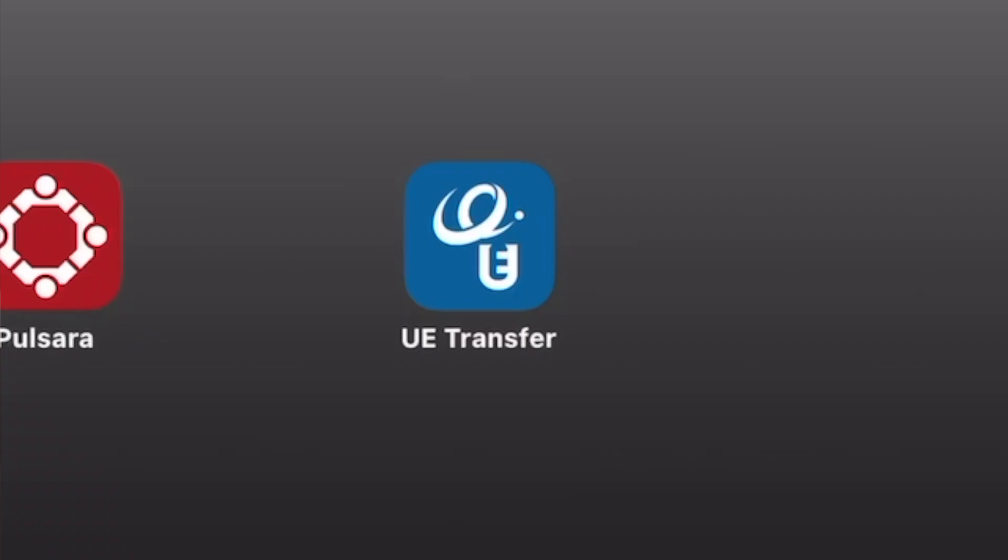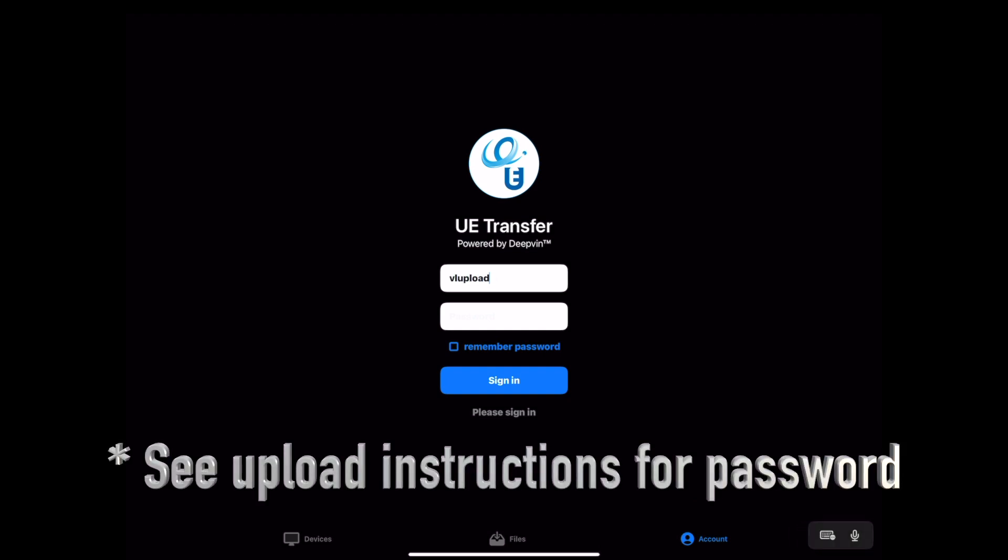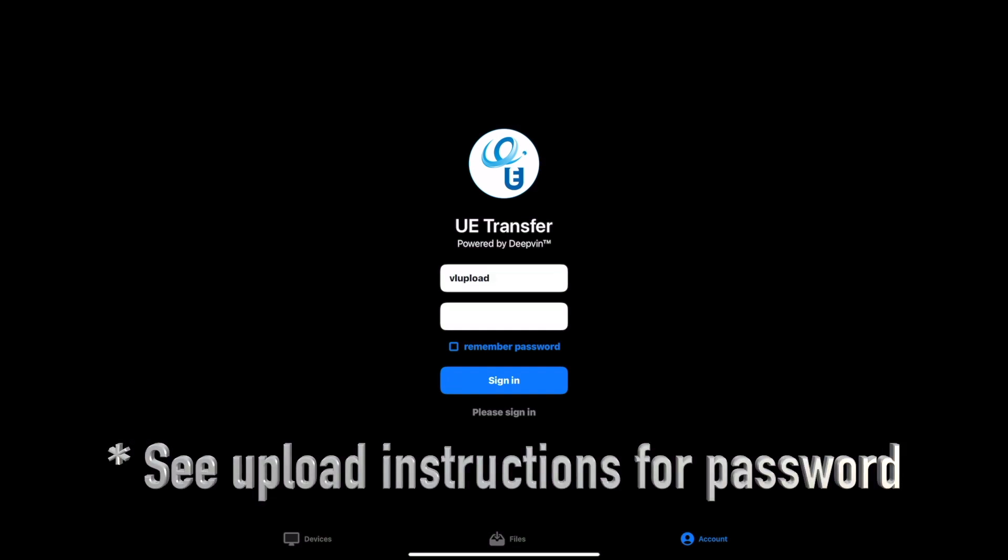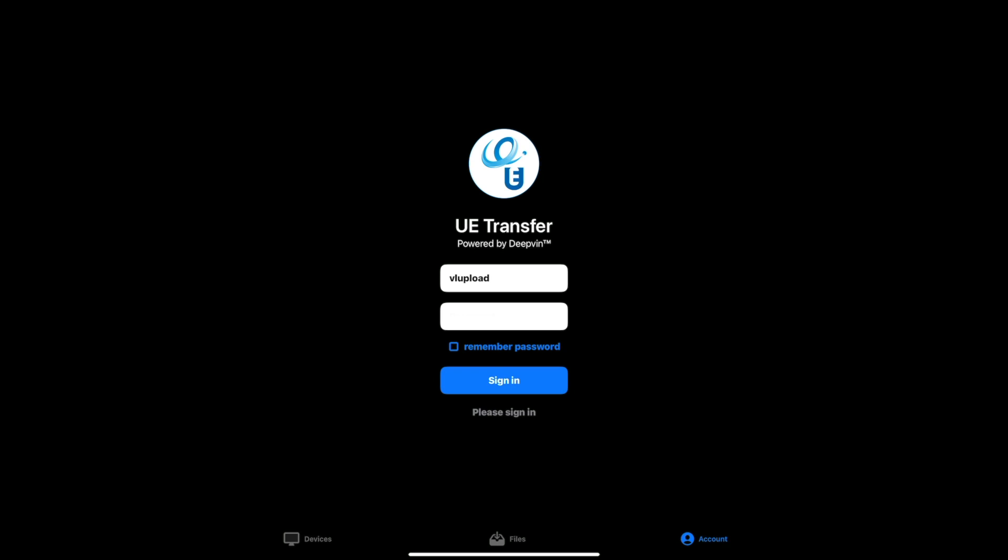Now, let's quickly go over how this process is going to work. First, make sure your iPad is connected to Wi-Fi. On your iPad, you will then tap the UE Transfer iOS Application icon. Once it's pulled up, you're going to enter the Universal Uploader Account Credentials on the app's home screen and tap Sign In.